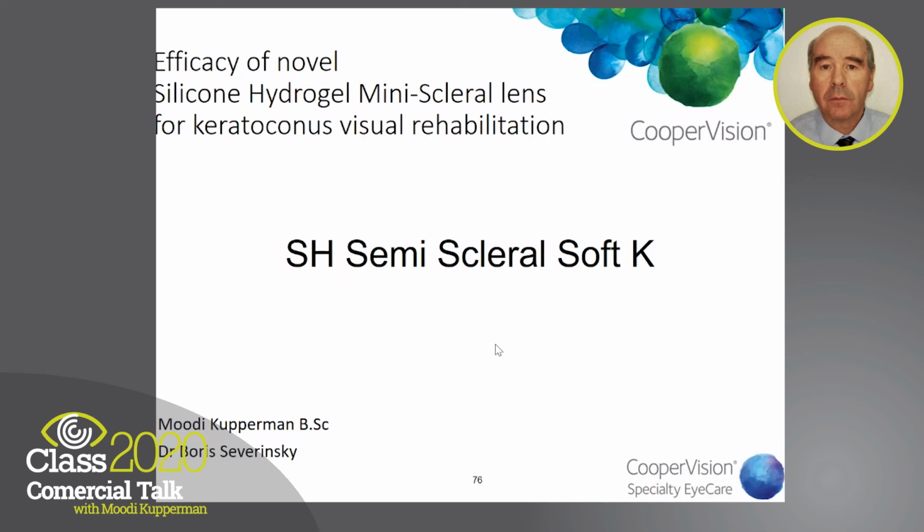So we decided to make a nice therapeutic lens that would offer both nice vision and nice healing of the cornea, which is very, very important when we are talking about operations that harm the epithelium layer.